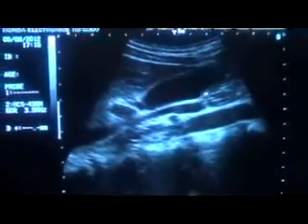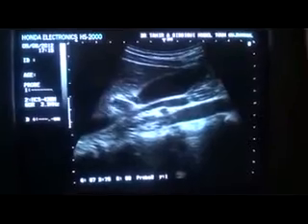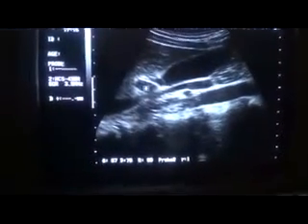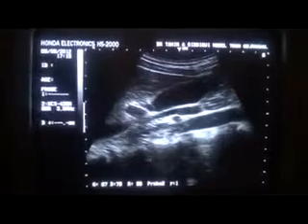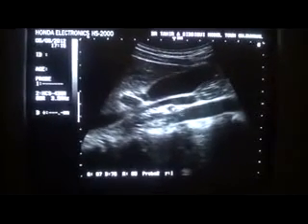Now in this particular patient, this is the fundus of the gallbladder. You can't miss a stone in this region. So now here we are seeing the fundus with the body, anterior wall, posterior wall. This is the portal vein that you will be seeing in this scanning plane. This is the inferior vena cava. This is the aorta, and this is the right renal artery in transverse section.